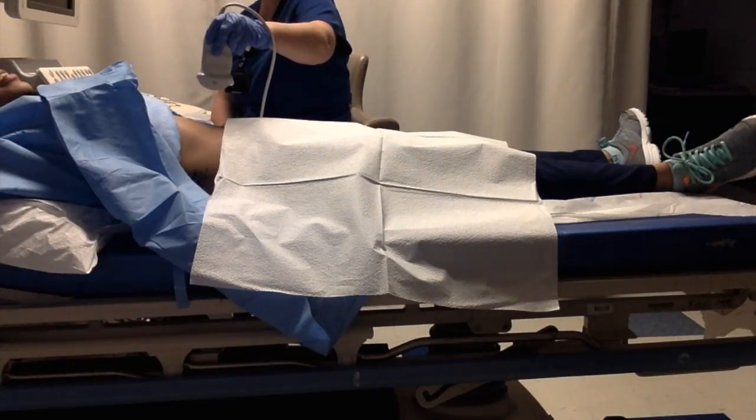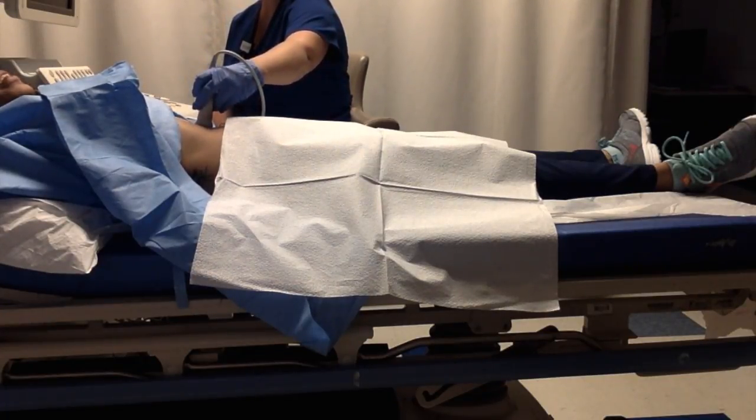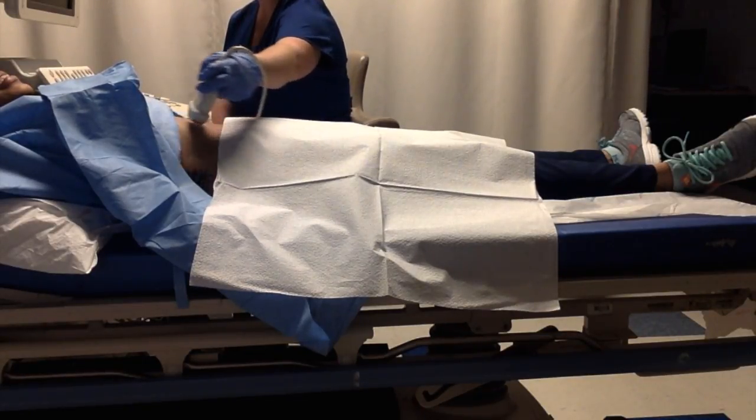A paracentesis begins with the patient lying supine and the abdomen exposed. Each quadrant of the abdomen is scanned in a sagittal and transverse plane with the transducer remaining perpendicular to the floor. The largest or deepest pocket from each quadrant is imaged. It is important to keep your transducer pressure light because excess pressure can distort the true amount of fluid.